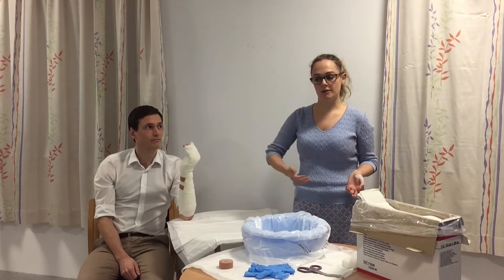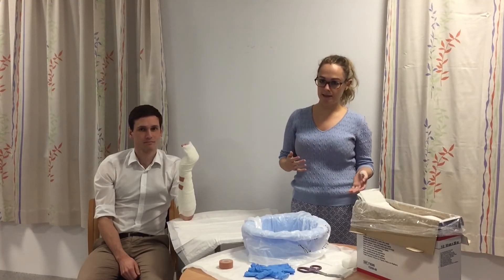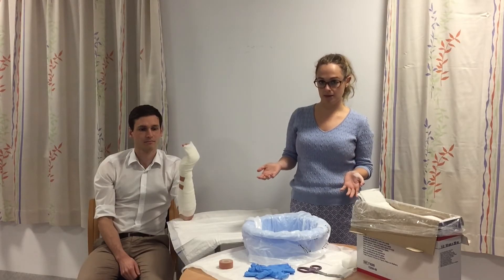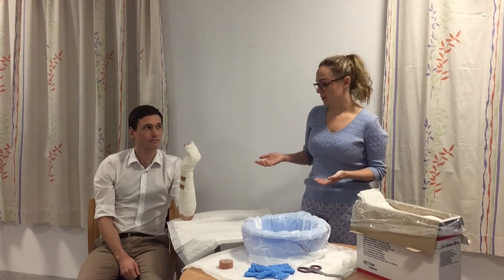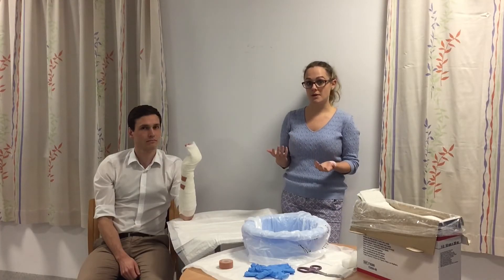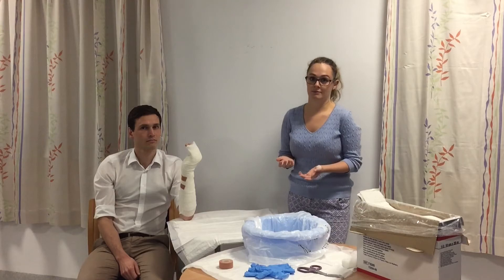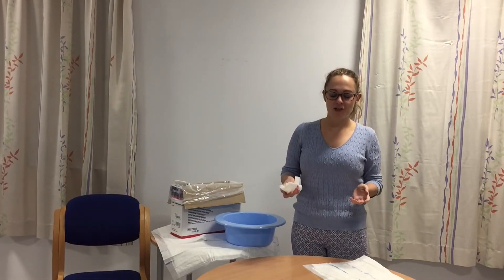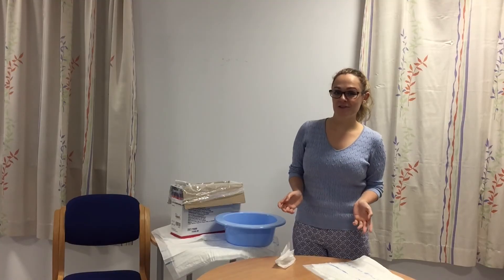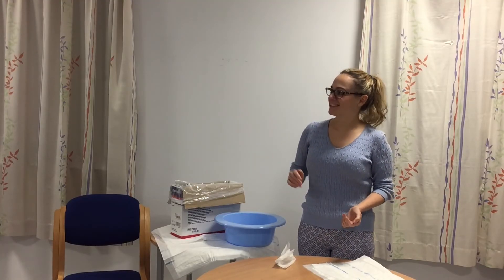Before the patient goes home, make sure they are elevated in a high arm sling, and make sure they have the appropriate follow-up planned. Tell the patient that if the arm becomes swollen or uncomfortable, they need to contact a medical practitioner straight away. Don't forget when you're finished to clean up your workspace, otherwise your life will not be worth living. And that, in a nutshell, is how we apply a volar slab.